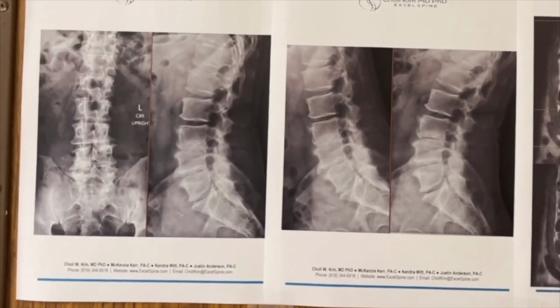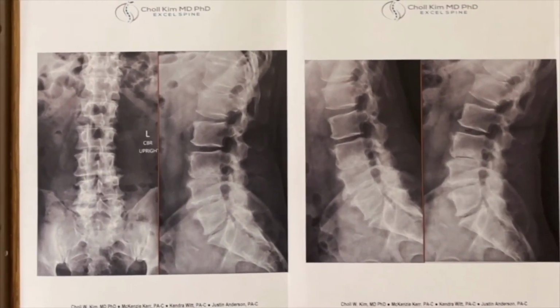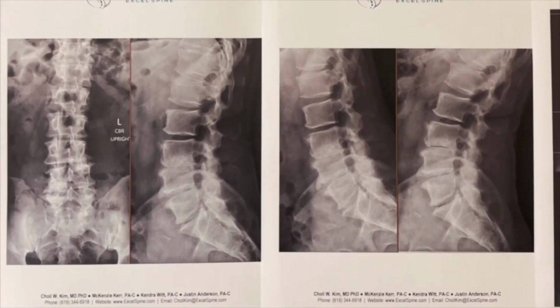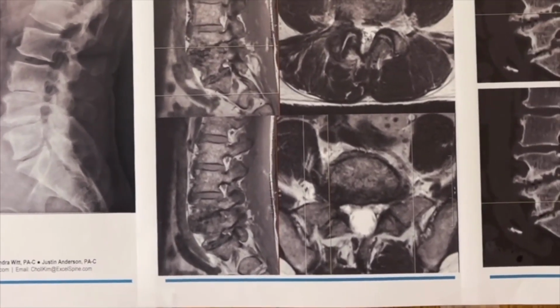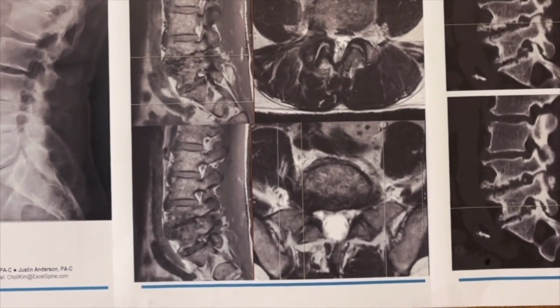Typically, this is treated with a fusion, but he's a professional golfer, and we need to get him back quickly without altering his back biomechanics too much. We want to do a very careful, meticulous, minimally invasive decompression of the nerve roots. They're probably all stuck down from the epidural scar, so we have to do a neurolysis as well.